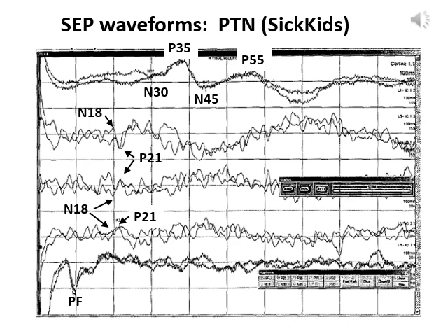In the bottom tracing, this is the peripheral response. We typically see a fairly large, clear, negative going peak, and that's the popliteal response.